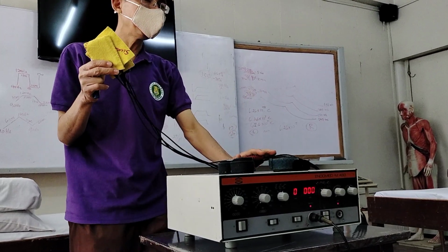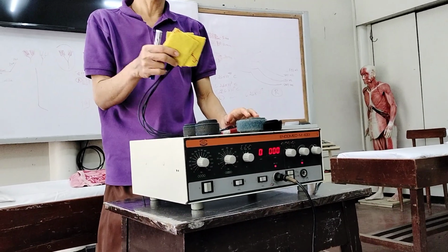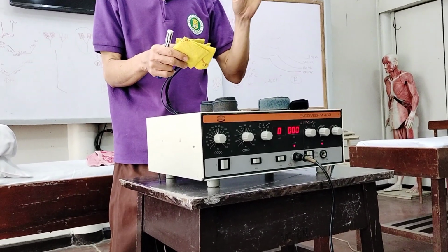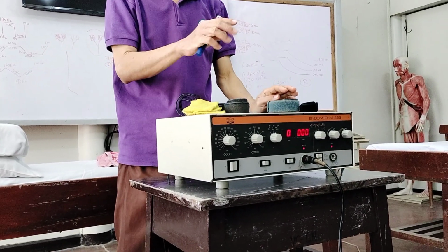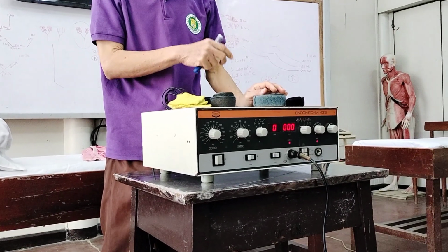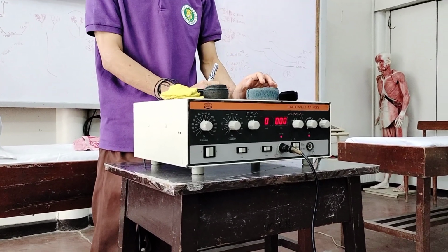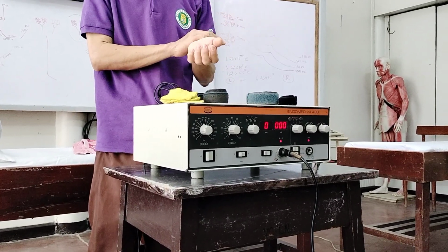with regards to the application to the muscle, you just have to apply a pair of electrodes. It is not possible for all 4 electrodes to be applied to the muscle. It is muscle stimulation, so you use one pair of electrodes. So, either red or black is your choice. Okay? If you're just stimulating one muscle, you can choose either red or black.